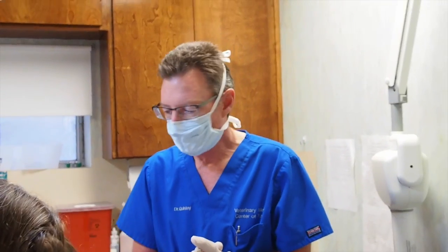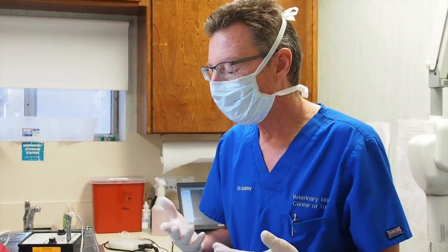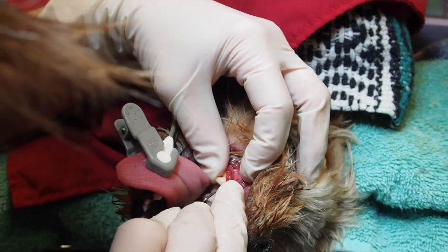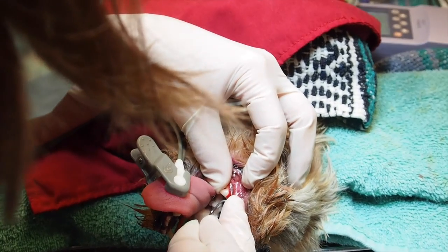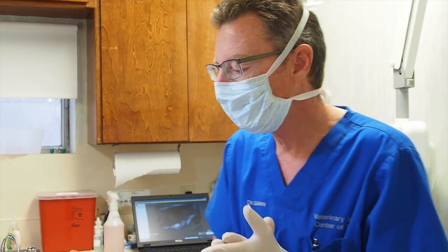The tip was fractured, which I didn't see in the exam room, but we did notice here, so we have an x-ray of that. So after she does the power scaling, she's actually doing the hand scaling, and we get up under the gum line, which is the most important part. If we don't clean up under the gum line, the gum disease will continue to progress, and just cleaning the crown, the tartar off the tooth, does absolutely no good whatsoever without cleaning under that little sulcus under the gum line. So that's what makes it tender on us when we go to the dentist and we have a little bit of sensation after we come out.